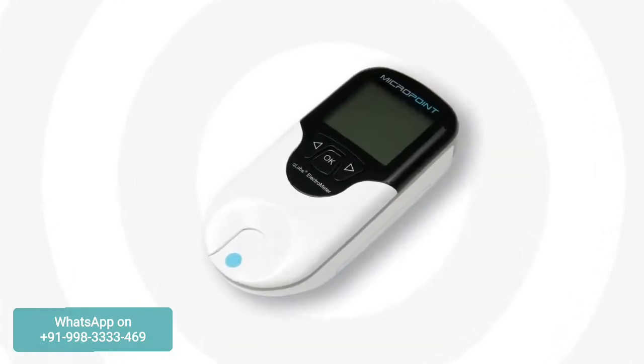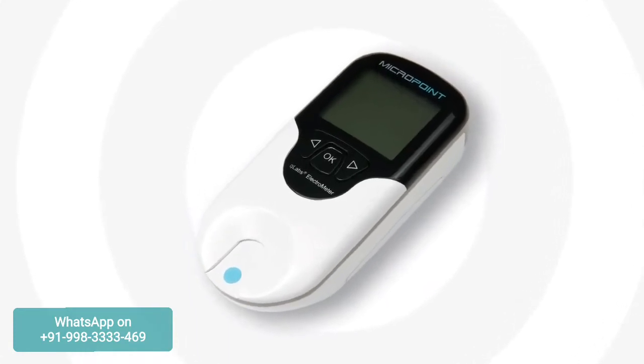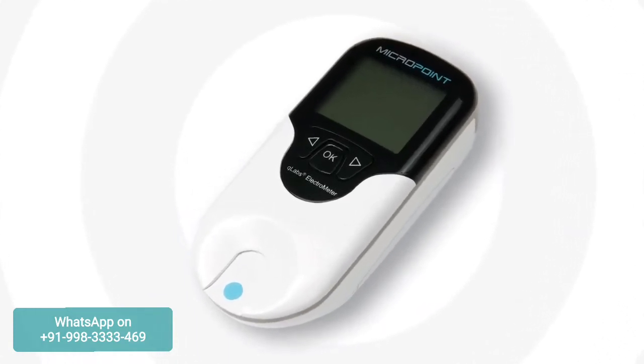Thank you for choosing the Q-Labs Electrometer, made for both healthcare professional and self-test use.